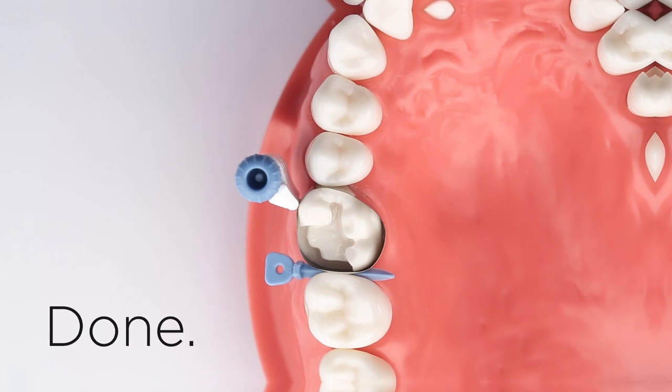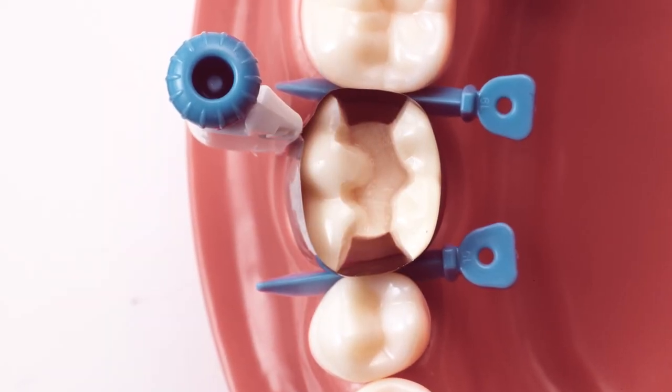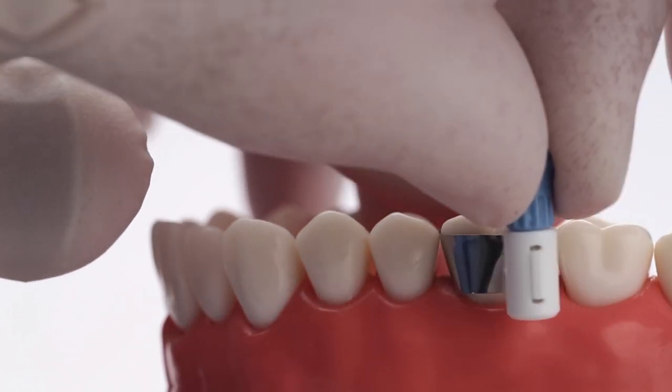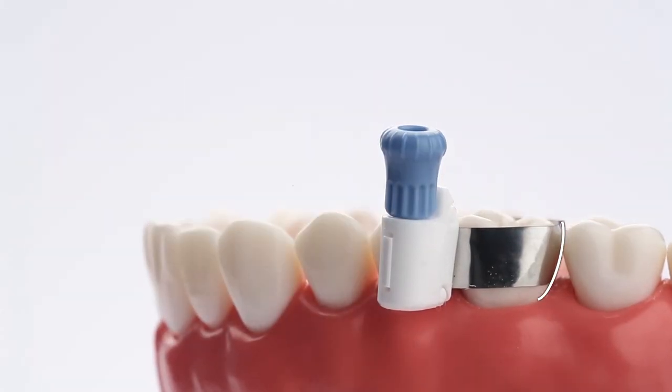It's that easy. The Paladin 360 system's versatile design means it can be positioned on a variety of buccal or lingual surfaces to accommodate field of view or loss of tooth structure. Its thin stainless steel band allows for proper subgingival and proximal contact adaptation. The matrix band recreates natural contours.